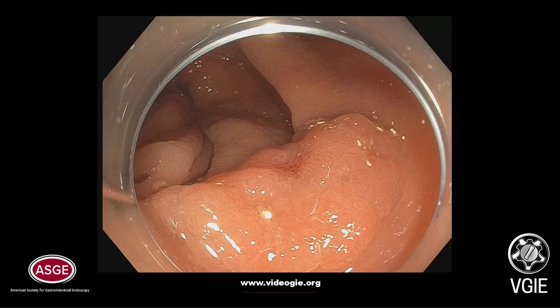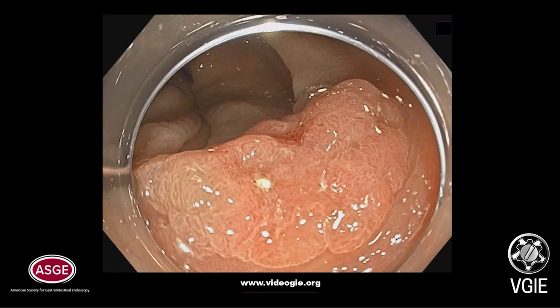The first case is that of a cecal laterally spreading non-granular lesion. Under white light, you can appreciate a subtle area of depression. Once the texture and color enhancement feature is turned on, it allows for a more detailed view of the lesion's surface pattern, highlighting subtle differences that may have been subdued under white light examination.